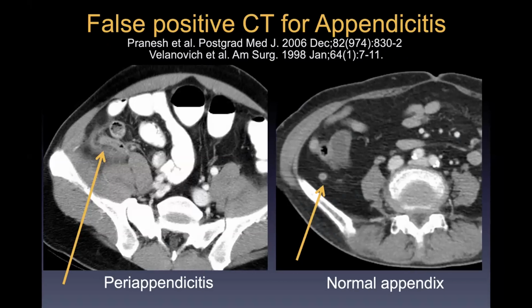Here are two such examples. I want to look at this one first, labeled normal appendix. So this was a case where we called early appendicitis, went to the OR, it was normal. I think probably these are just little vessels in the mesentery and somebody mistook it for fat stranding, just an overcall, an overcall of appendicitis.